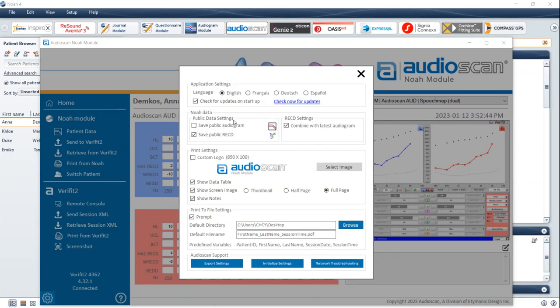The default saving behavior for the AudioScan NOAA module can be configured in the Public Data Settings section. Save as Public Audiogram is unchecked by default, meaning that data from the equipment will not be saved as the latest public audiogram for use by other modules. Save as Public RECD is checked by default, meaning RECD data retrieved from AudioScan equipment will be made available for use by other NOAA 4 modules, such as Hearing Instrument Manufacturer modules. In the RECD settings, checking 'combined with latest public audiogram' groups RECD data retrieved from an AudioScan product in a separate session with the most recent public audiogram for that client available in the NOAA 4 database. This parameter is applied when the RECD is measured using the dedicated RECD test screen with no other audiometric data in the AudioScan device at the time of data retrieval.